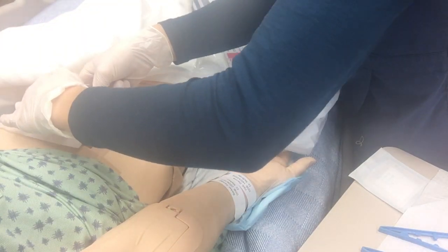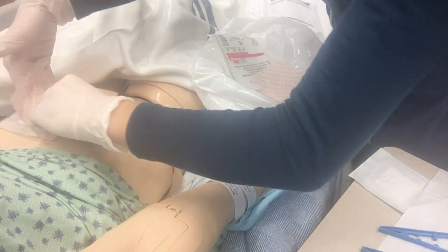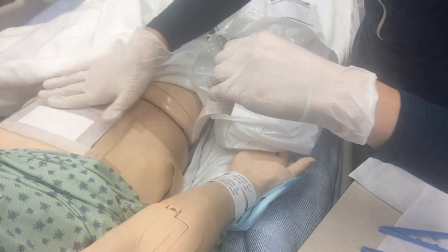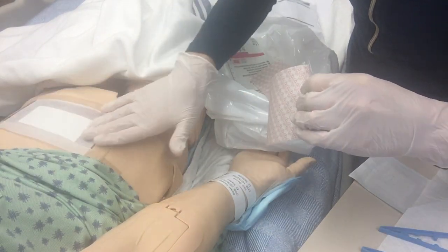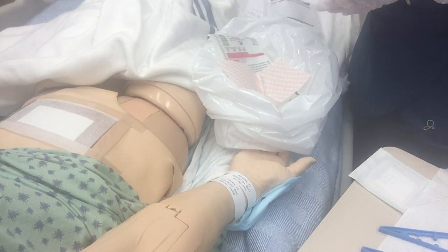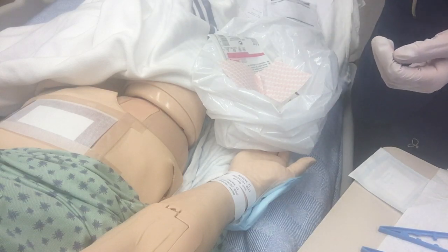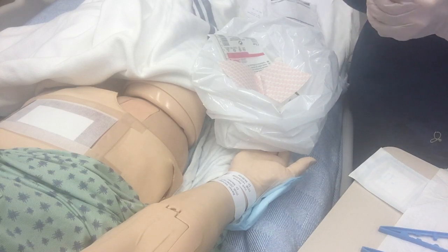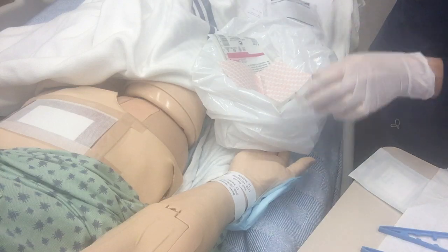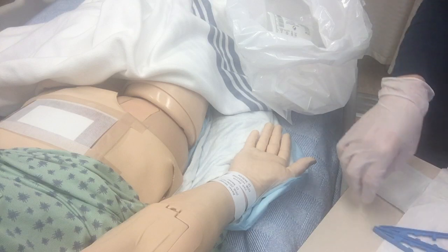Using light pressure and making sure that there's no wrinkles, and then taking this flap without touching the bottom and folding it over, smoothing it out as I go, and making sure all of the stickiness adheres to the skin. And then I'm checking in with my patient to see how she was doing for that process, see if she needs anything, and if she is happy with that, I am going to start cleaning up my field. So packing up all of this stuff and emptying my field.